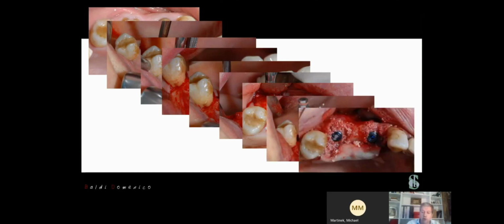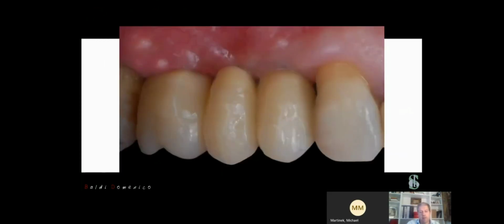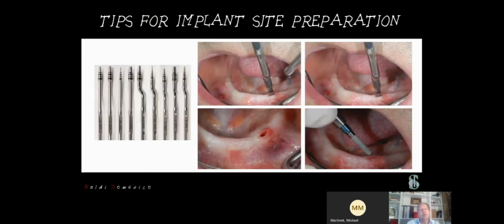Of course, here I prefer to fill the hole and wait for the healing of our surgery, and then we can finish our surgery. But with the magnetic mallet, we can also prepare the implant site directly, like in this case, without cutting the soft tissue, without a flap, in a flapless way. So we can prepare the implant site immediately, and we can place 2 implants of 3 millimeters. And in this way, we can really be less invasive.